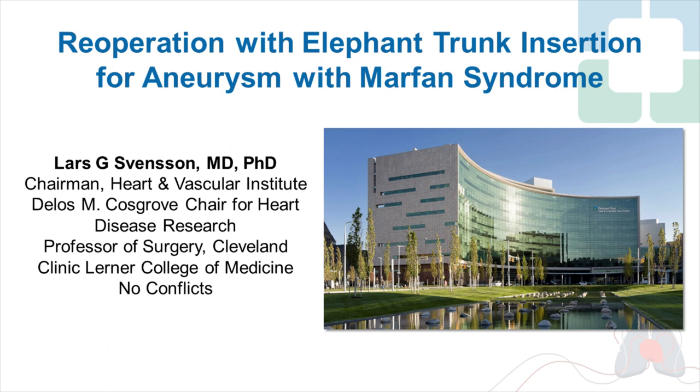Hello, I'm Lars Svensson, Chairman of the Heart and Vascular Institute at the Cleveland Clinic. I thought it'd be useful to show a video of how we do the elephant trunk procedure — a modified elephant trunk procedure. This is the technique we found very helpful. In the Prospector Randomized Trial we did, about 60% of patients had elephant trunk procedures for total arch replacements looking at brain protection. The overall mortality rate was 0.8% and the stroke rate 0.8%. I thought it'd be important to share how we do the procedure and some of the things that are important.